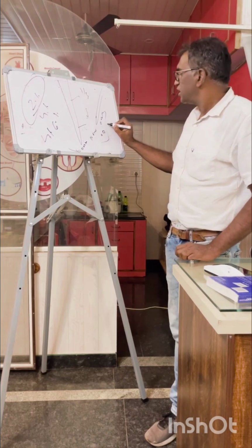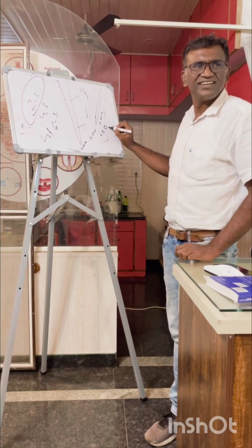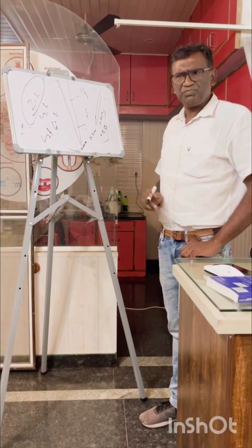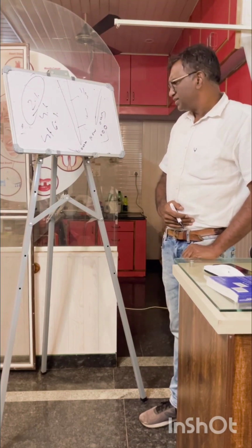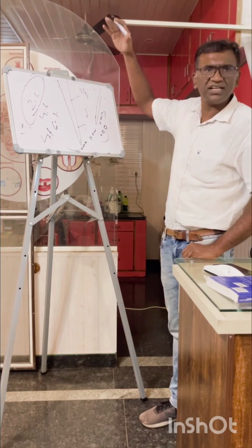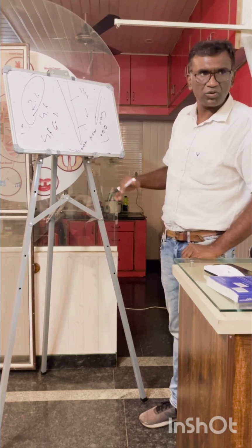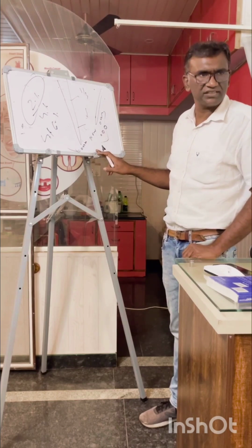We should always tell this percentage, why not in millimeters? They have divided the percentage for 2, 4, 6 according to the root length, a ratio, a relation, for convenience.